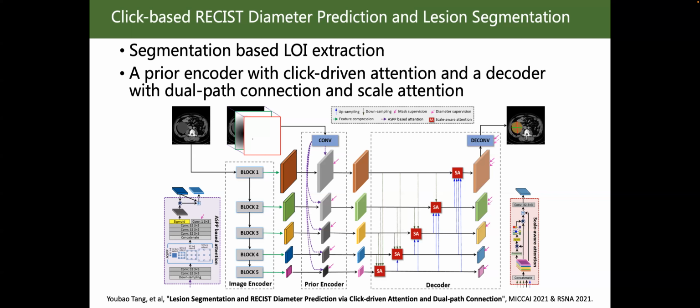Second, the click information is introduced using the same construction strategy for different lesions. We use the same parameter setting to generate the distance transform image for all lesions in the previous method. So this strategy treats lesions with diverse sizes and shapes in the same way, and it may not be optimal for locating the lesion regions precisely.